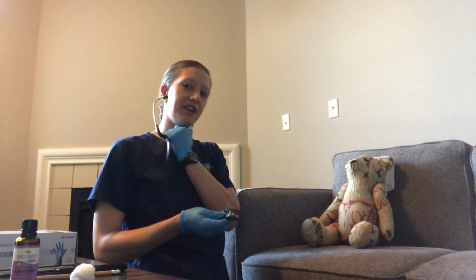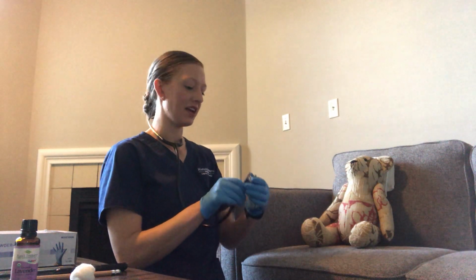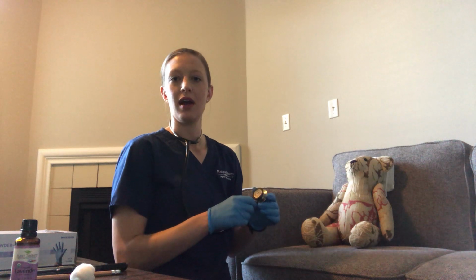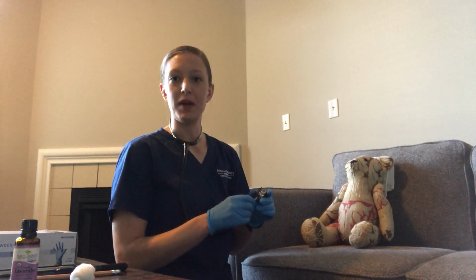For the purpose of this video, I'm not going to have the stethoscope in my ears because it makes it a little bit harder for me to hear what I'm saying. So the 5 areas that I'm going to listen to in the heart are the aortic, pulmonic, Erb's point, tricuspid and mitral areas.